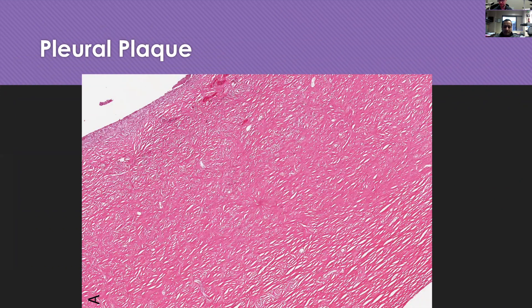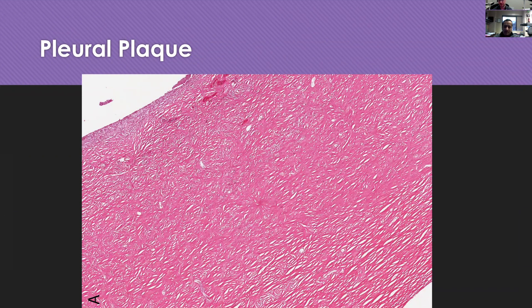This is a nice contrast showing a pleural plaque. It has a very nice basket-weave appearance — that's the classic buzzword you often hear with this. It looks like collagenous-type fibrosis with little holes or spaces, like someone has woven all these little collagen bands together. The big differential for me here is a desmoplastic mesothelioma. One of my mentors always taught me that the desmoplastic looks spooky and swirly — not this uniform basket-weave appearance, but you'll start to see swirls that have an almost spooky appearance, which is a tip-off that something more is going on. A pancytokeratin can be really helpful to highlight that morphology.